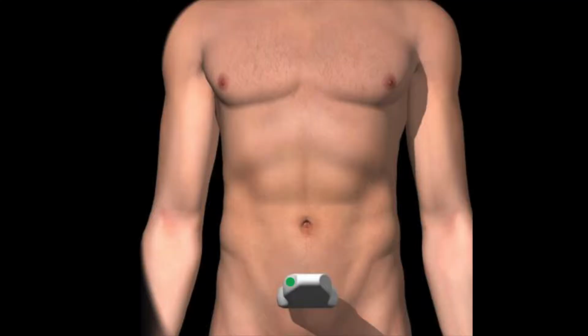It's kind of boring. So as sometimes will happen in live recording, life gets in the way, a trauma gets called, and we have to leave the bay pretty quickly. In this case, when we came back to the bay, we picked up with the thorax scan, and so I'm going to show you the second half of the pelvic scan here on this digital image.